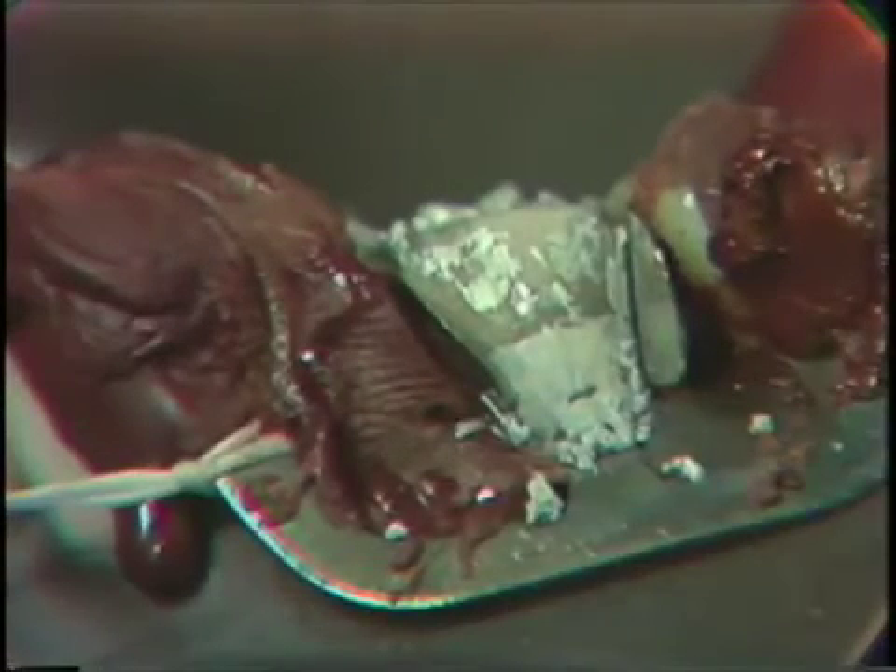You must expose the wedges so that you can get them out. Then we go back to our carving. This requires that you remember where the margins of your cavity preparation end. It is very important that you realize you want to carve back to the prepared surface of the tooth, and unless you can remember exactly, the amalgam has been condensed out beyond these margins. It is necessary that you cut off all of that overhanging amalgam.